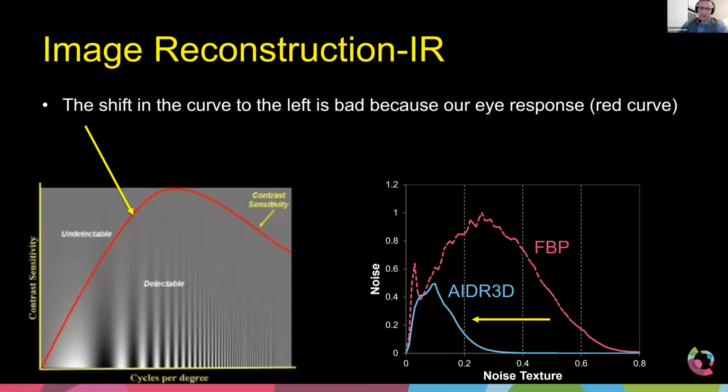You're going to say, okay, well, it's fine. The texture changed. Why is that a bad thing? If you look at the way our eye responds to resolution, our eye is optimized for this middle to kind of higher resolution range. When objects are too close together and too sharp, our eyes actually lose a little bit of sensitivity to our ability to distinguish those edges. But it's even worse when the edges get blurrier and more coarse.